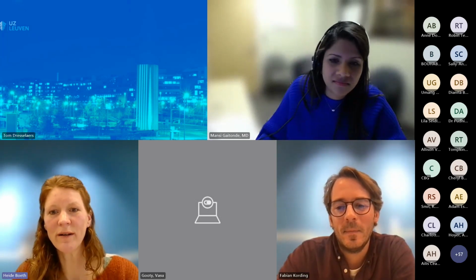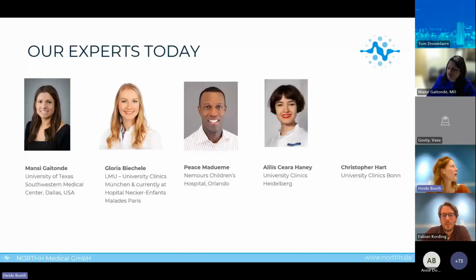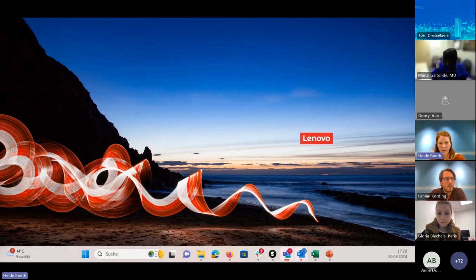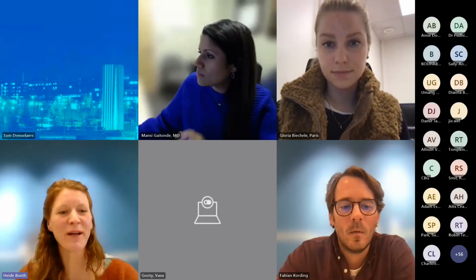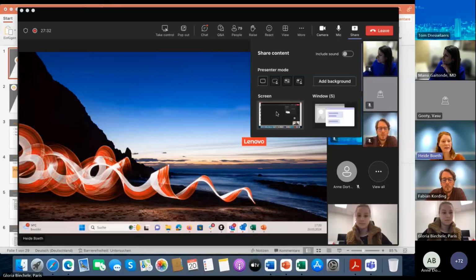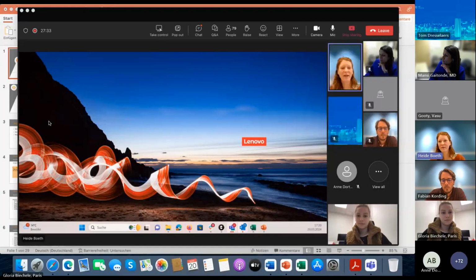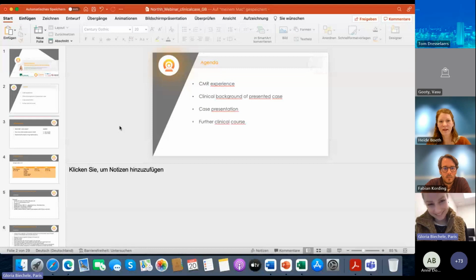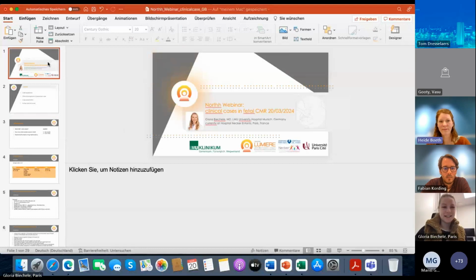All right. We will now jump to our next speaker, our next expert, which is Gloria from University Clinics München. Currently, Gloria is working at Hospital Necker Enfant Malade in Paris. Gloria, great that you are here. I will now hand over to you directly. You already shared, and we can see the slices.